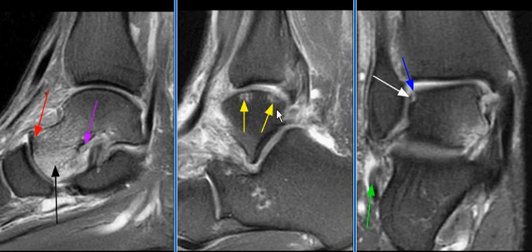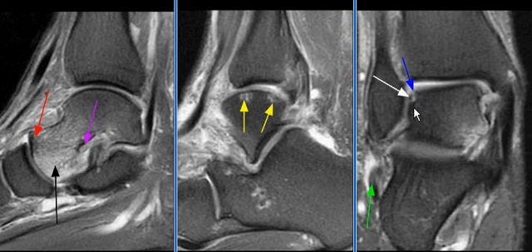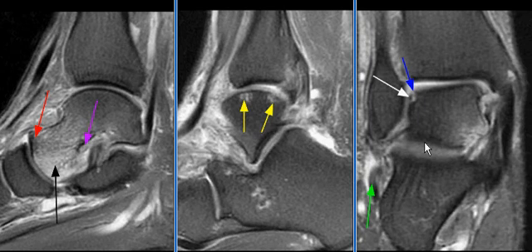There are two osteochondral lesions in the medial and lateral talar dome. The posterior lesion demonstrates disruption of the medial subchondral plate and a 4 mm excavation with a 2 mm indwelling fragment. No adjacent edema is seen.